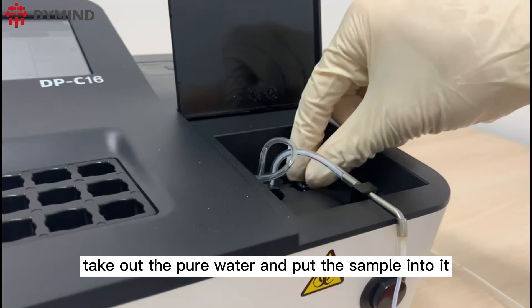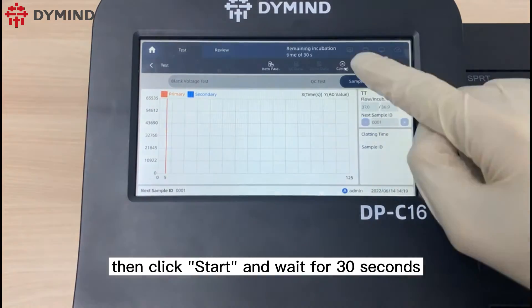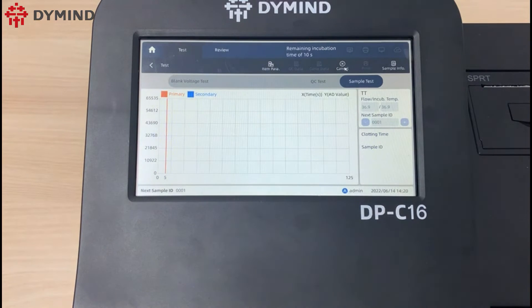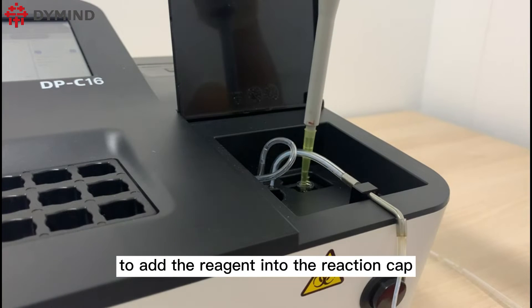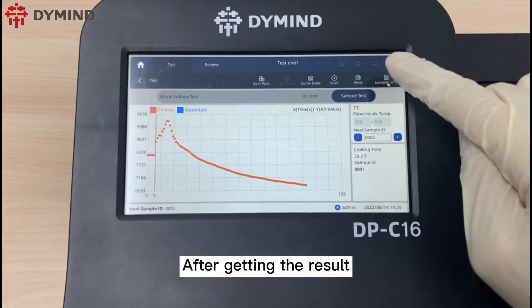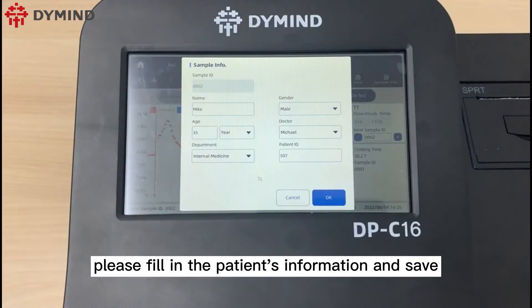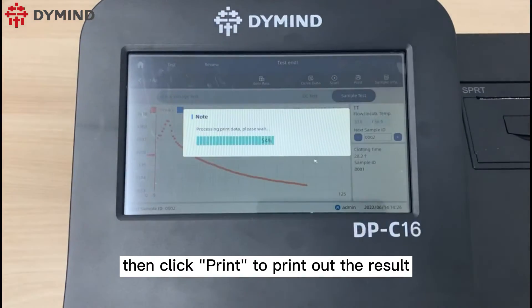Open the cover, take out the pure water and put the sample into it, then click start and wait for 30 seconds. Please follow the instruction to add the reagent into the reaction cup. After getting the result, please fill in the patient's information and save, then click print to print out the result.